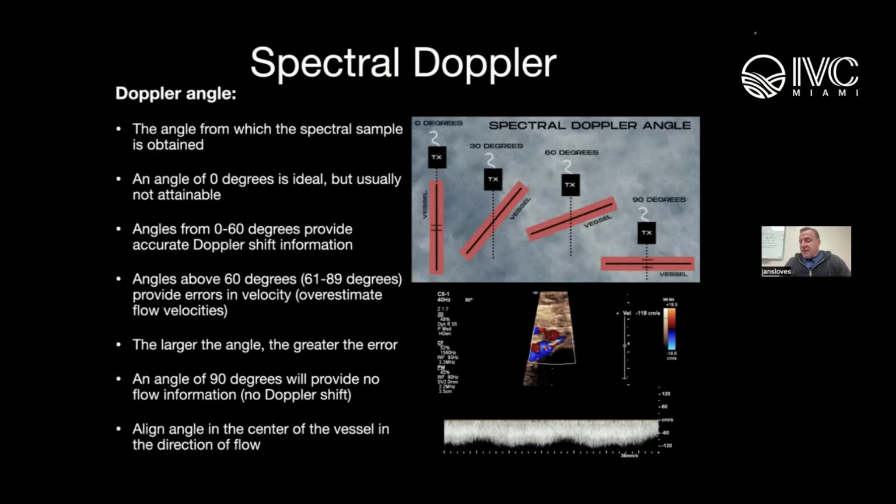Well, for those of us that have done many echoes, right, the way your ventricle and your atria on your right and left hearts, the way we insonate this in cardiac ultrasound, and the way that the valves open, this is kind of how we work, right? We work straight up and down, so we don't put an angle on that. But with vascular ultrasound, that's a completely different story.